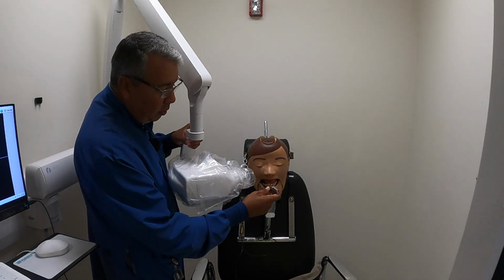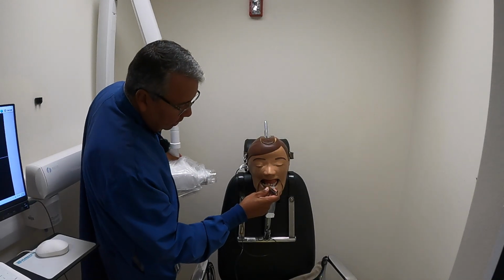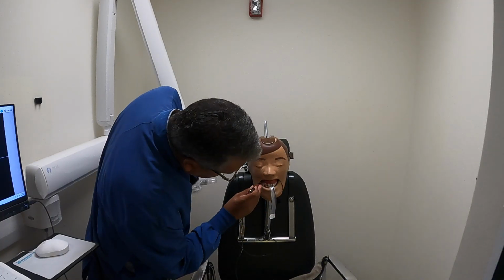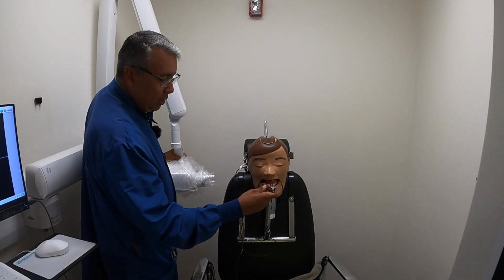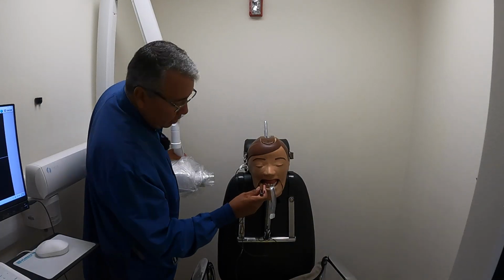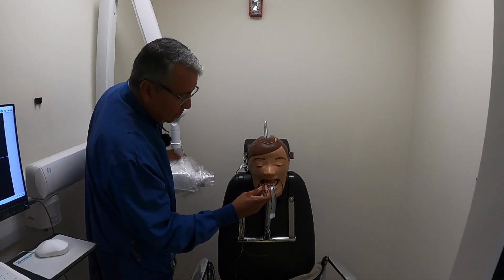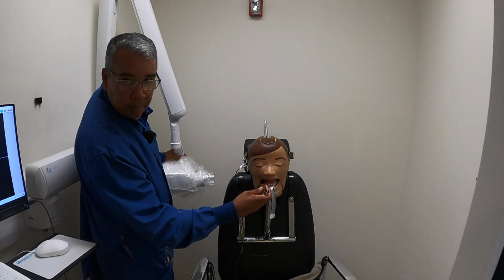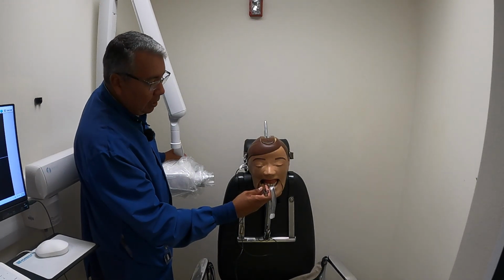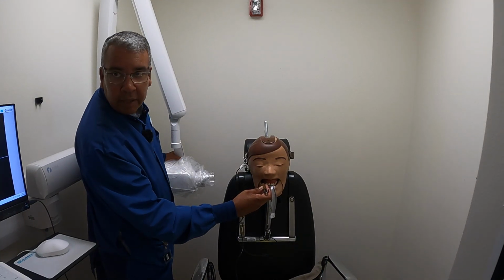But we're not taking molars. So the molars look like this. They're not at this angle, they're at this angle. These are the molars, these are the premolars. The molars, I'm putting this all the way up against the third, the second, the first, and I'm trying to consider that second premolar because I am trying to include that in there. That is the horizontal angle of those molars. Is this making sense? In comparison to what you guys just wrote down.